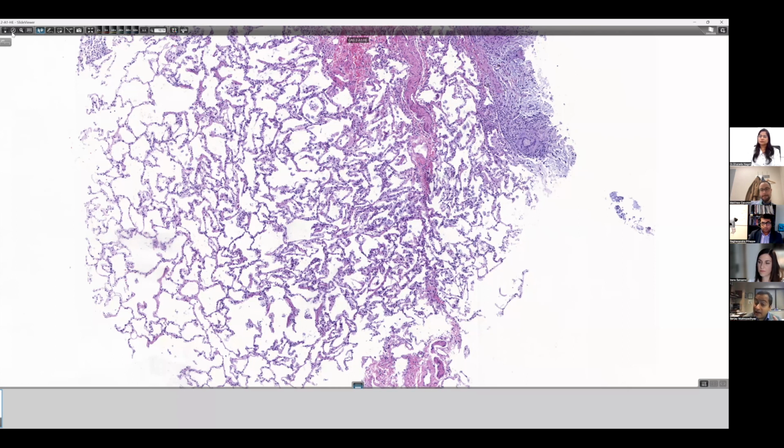And if they are sarcoid-like, like well-formed granulomas along the lymphatics, I actually suspect those really are sarcoidosis. So if you have all the features of sarcoidosis, it probably is sarcoidosis along with a tumor. I don't think that the odd granuloma here and there really deserves the label sarcoid-like. But I'll open it up to the others. What do you guys think?